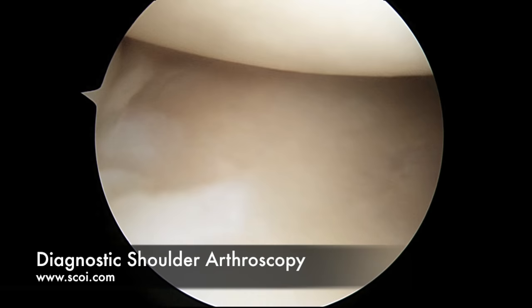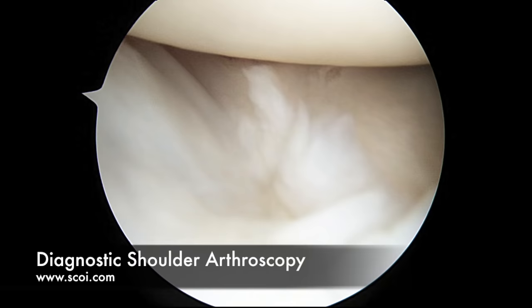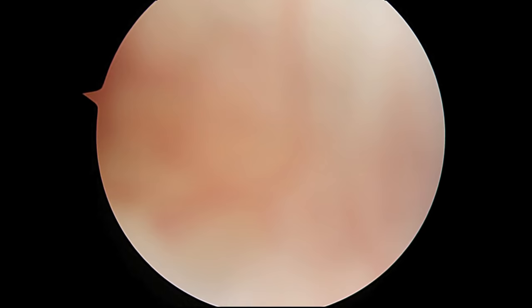We can see the ball moving back and forth. We can look up at the undersurface of the posterior aspect of the rotator cuff where we have just debrided a little bit — there is no full thickness tear there. We can come to the anterior aspect of the shoulder and look at the anterior labrum, and come up the front of the shoulder until we can see the subscapularis muscle right here. It has its own little pocket that it lives in. Everything looks quite normal.